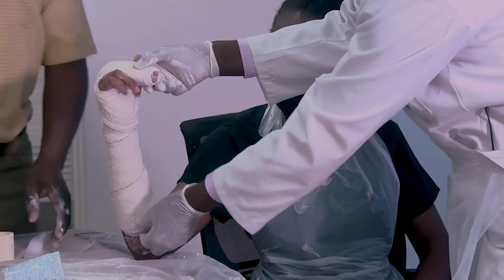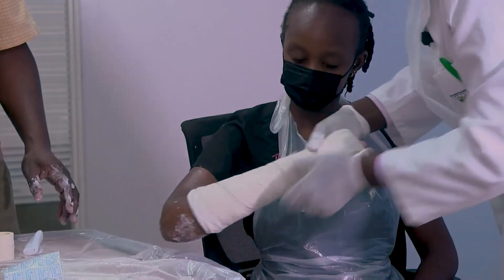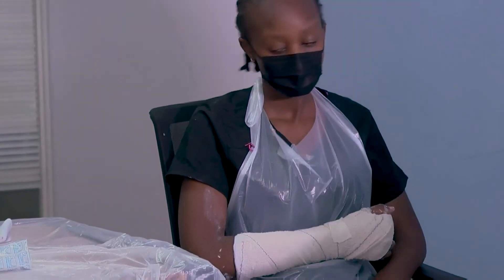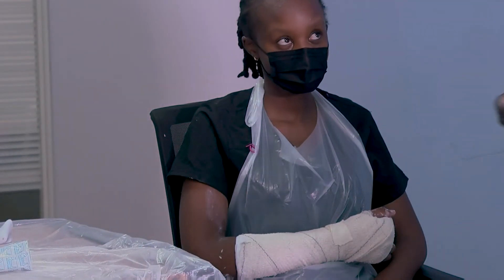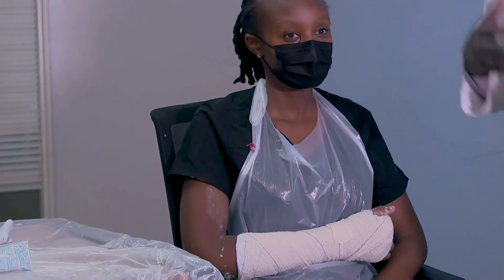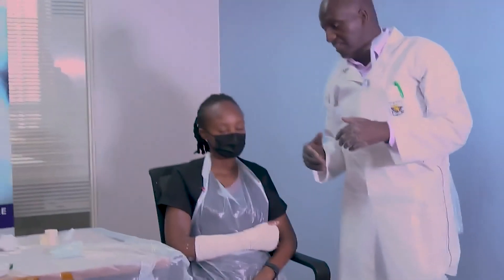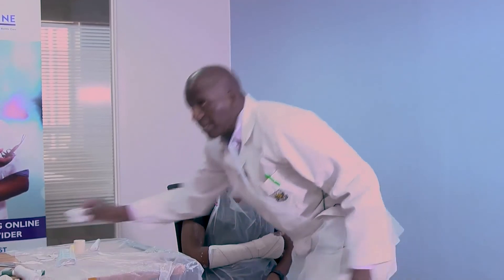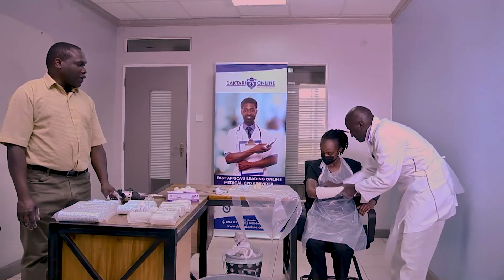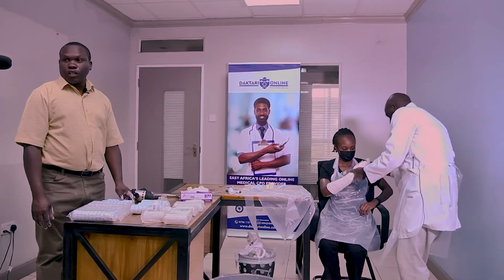Then you can secure with strapping tape and clean your patient. Ensure the hand is rested in that position. Give instructions on how to take care of this radial gutter splint. The patient should be followed up in the clinic until the splint is removed. Thank you very much, Zach and Cynthia, for that very good demonstration, and thank you for taking your time to watch.